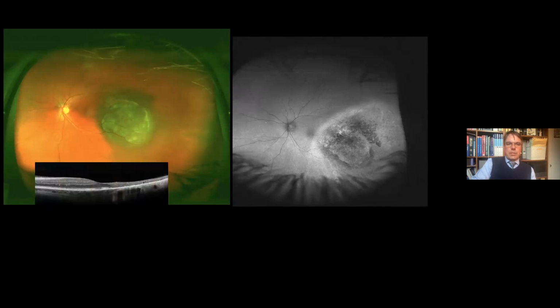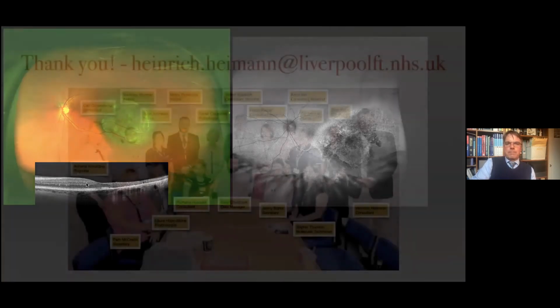Okay, and you can also use the OCT. You can see the difference in the fovea: here the normal retina where the fovea is, and towards the optic disc you can see the retina is a lot thinner. What that means is that on the OCT, you can see the effect of the plaque. Obviously, it doesn't only kill the tumor, it unfortunately also damages the retina, but you can use that indirectly on the OCT to see where your radiation effect was. So this tells us the plaque was in the right position, and where the retina should still survive, it survived. So it's an indirect sign for us, using these scans in daily clinic life, that the retina is still alive where it should be alive, and that the plaque was in the right position.